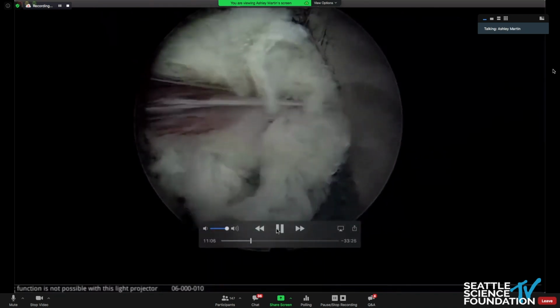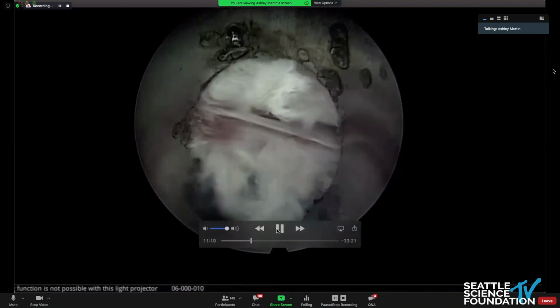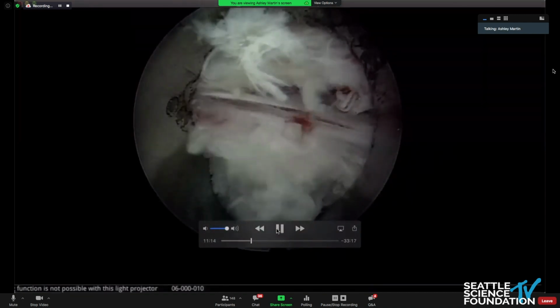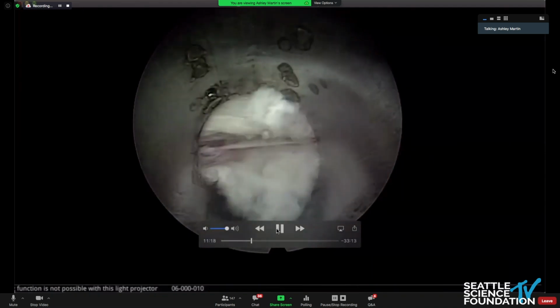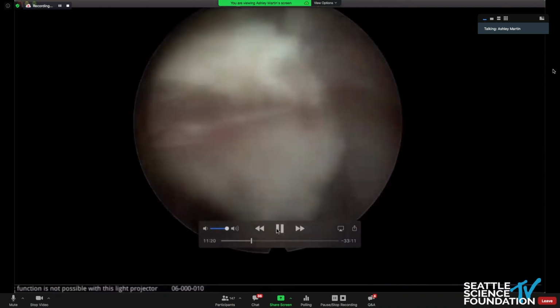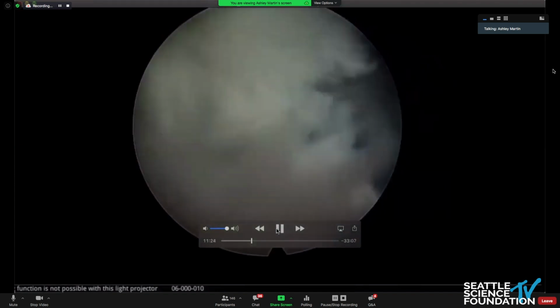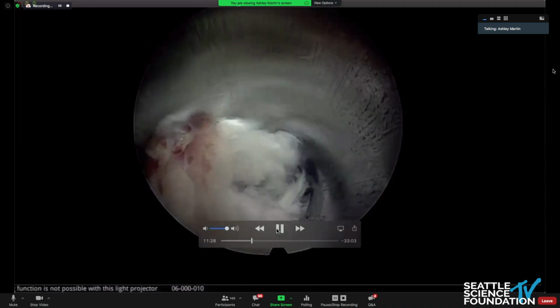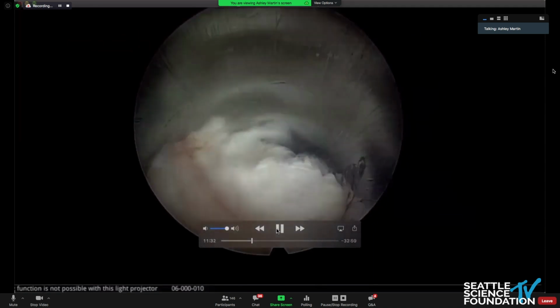Take a picture right there. Let's view the epidural space. Take a picture right here. Okay. So that's in the epidural space dorsally. Just kind of spinning this around, looking. So now I would be looking towards the left where the nerve root would be. There's some epidural fat in the foramen.